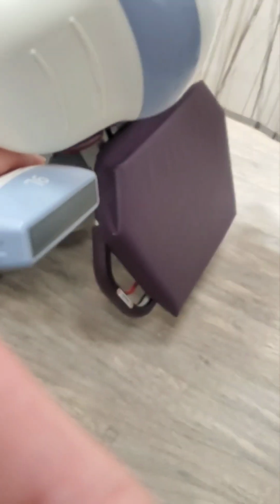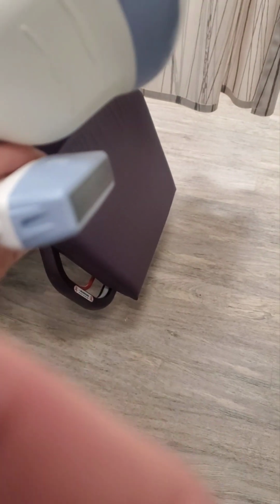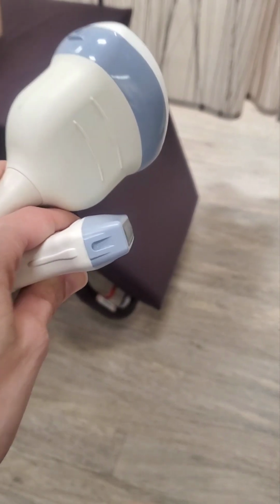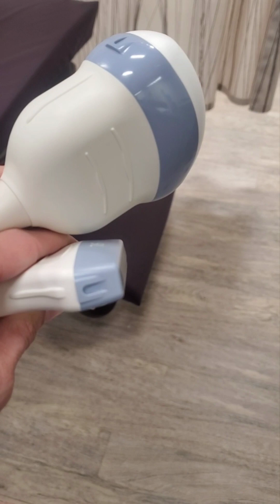And if you think about how that sound beam is going to come out, which of the resolutions is that going to affect? This way to this way, that sound beam is going to be how it's narrowed in the side by side, right? That's going to be your lateral resolution.